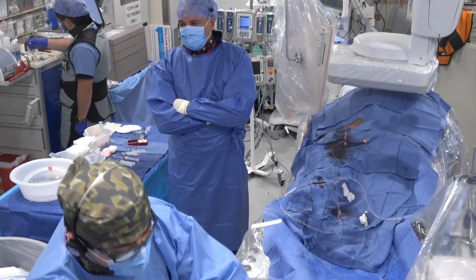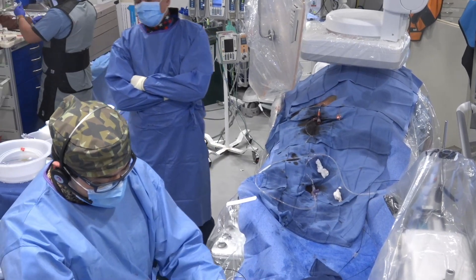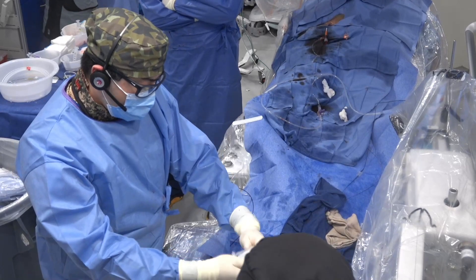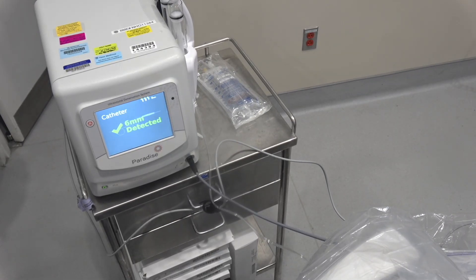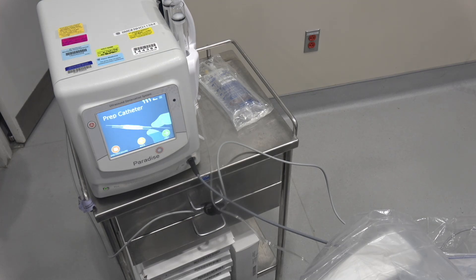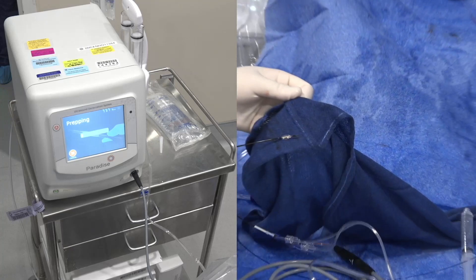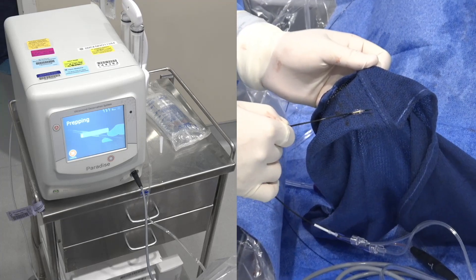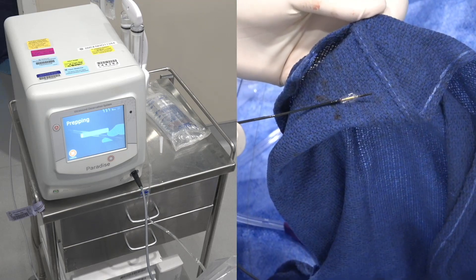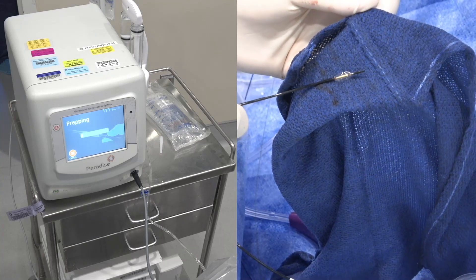You can ensure apposition on the vessel by testing, and I'll demonstrate how to do that. I want to emphasize that I don't think IVUS is necessary, but if you have it, it's reasonable — though not mandatory for the success of this device. We are now going to prime the device. The 6-millimeter catheter has been detected. You press a button and it preps the catheter — the balloon is inflating and deflating, removing all the air. The machine does it for you, taking all the guesswork out. This is probably the longest part of the procedure, but it's important because you don't want any air in the system. The wait is worth it.